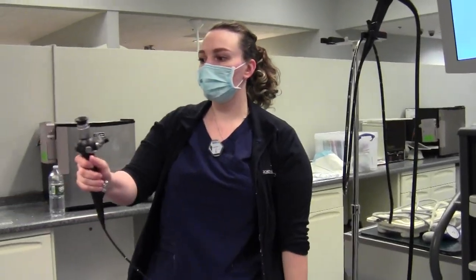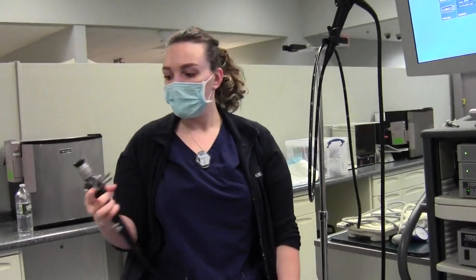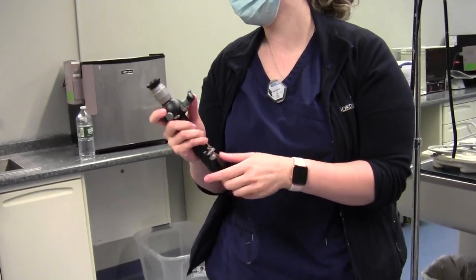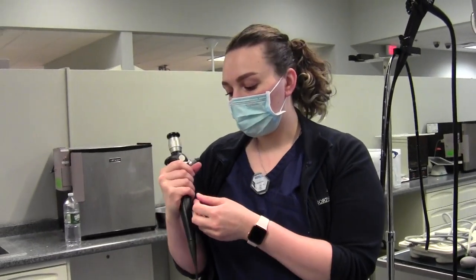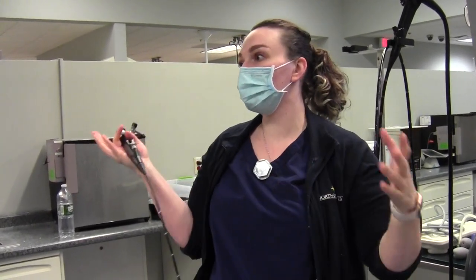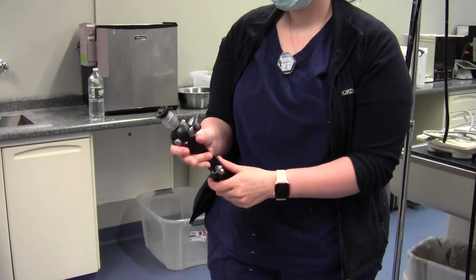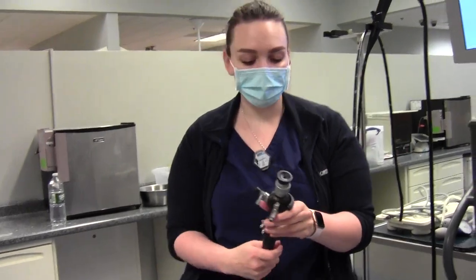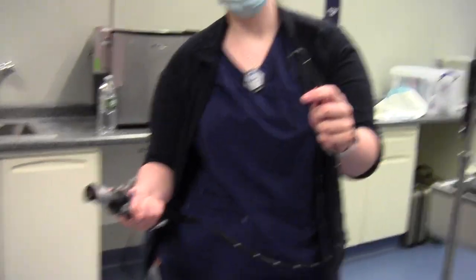With the bronchoscope, as you can see it's just the scope itself, so we have to attach an external camera and light source to it. There's a suction button here and a channel where they can put instruments through. Sometimes you can suction through there too, or we'll flush — in small animals where we can't fit any of the other scopes, we'll do what we call a 'ghetto insufflation' where we get a syringe with air and just keep inflating to open up the stomach or visualize the area. We're going to hook the camera up to the top portion here and the light source will twist onto here. There's a little button that moves up and down, which turns the scope in two directions.